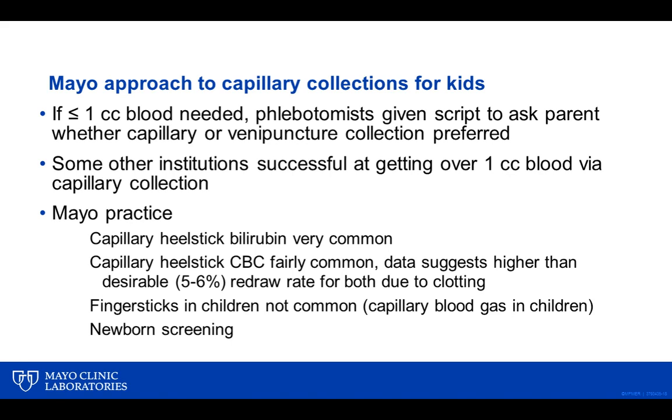We have about a 5 to 6% redraw rate for capillary CBCs, whereas when we do venipuncture, it tends to be a little lower. We don't do a lot of finger stick testing in children. Most children and parents of children who are old enough to sit still and get through a venipuncture procedure will choose to do that. So our capillary puncture in our practice is mainly limited to infants in the first 2 to 3 weeks of life.